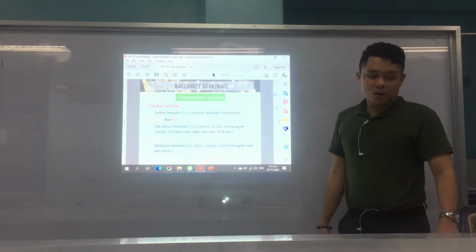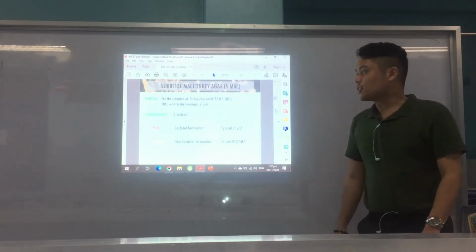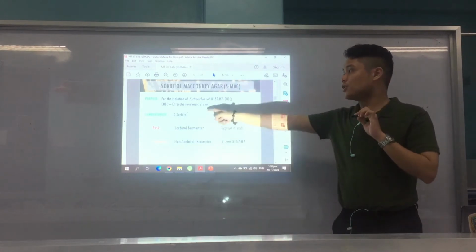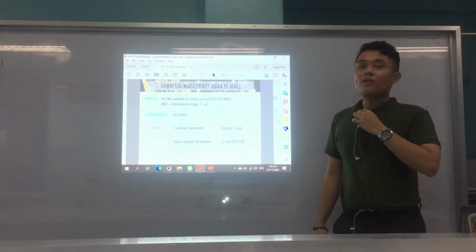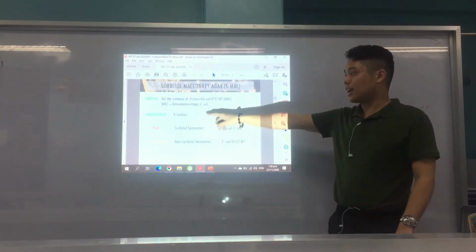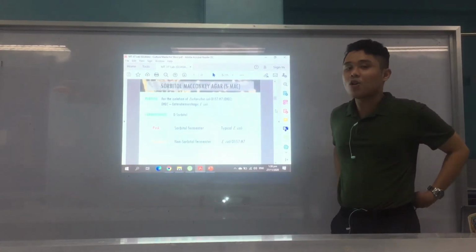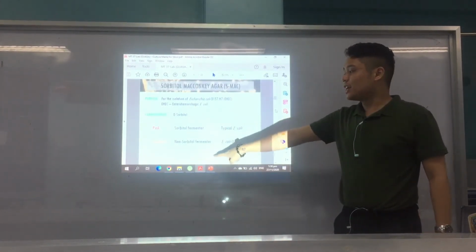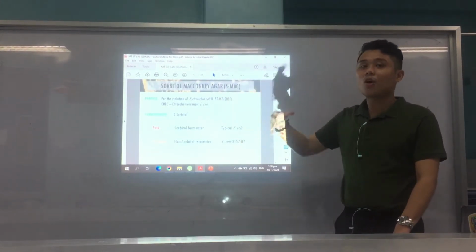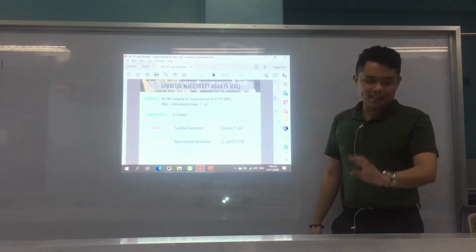Okay, again, colorless colonies. Okay, next culture medium is your sorbitol MacConkey agar, as mentioned, again, SMAC. It's for the isolation of your EHEC or E. coli O157:H7, or enterohemorrhagic E. coli. And the difference there is the carbohydrate, which is D-sorbitol. Why is this? Because again, E. coli O157:H7 is a non-sorbitol fermenter. That is why the significant colonies on SMAC are the colorless colonies, because we are looking for E. coli O157:H7.